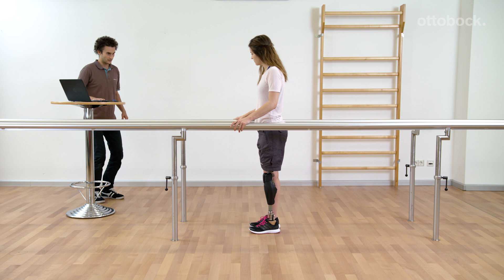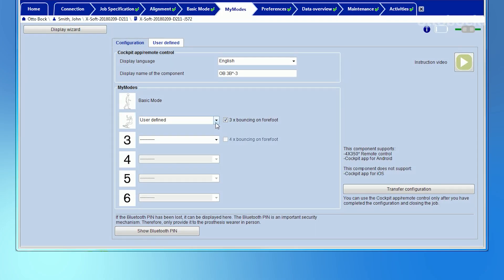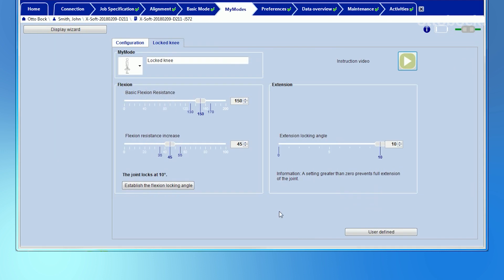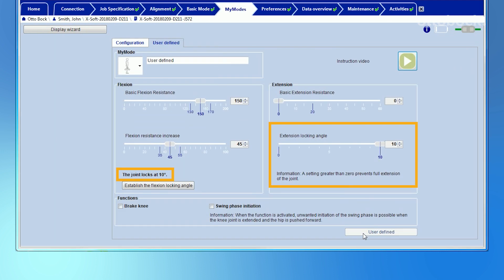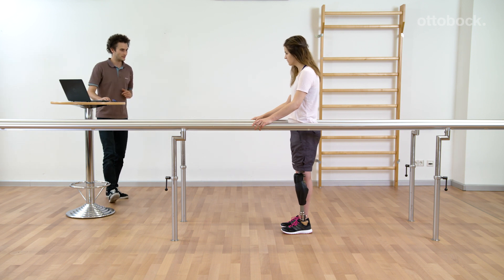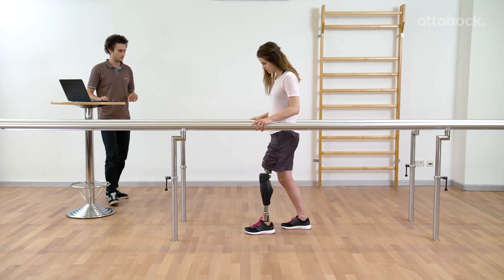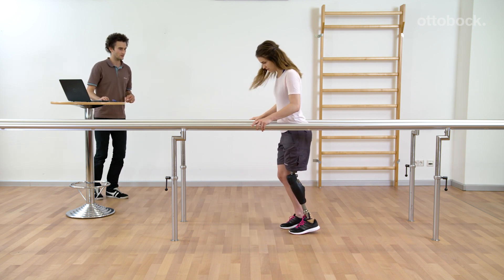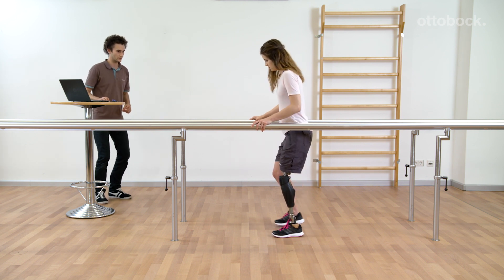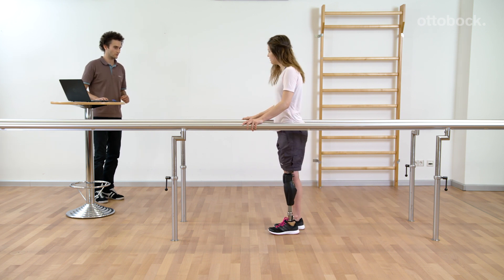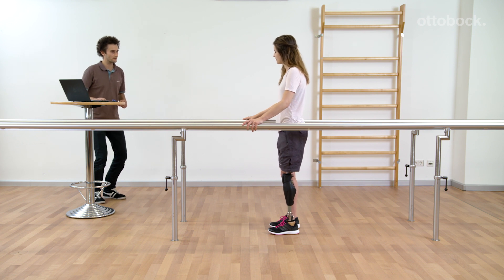Complete extension of the knee joint is always necessary to release stance. However, the extension lock can prevent this necessary knee extension movement from occurring. The last example is the Locked Knee My Mode. This preset restricts the knee joint in both flexion and extension at 10 degrees, meaning it is completely locked in a flexed position at 10 degrees. Adjust the flexion angle first and then set the extension angle to its maximum. To extend the knee joint completely, hold the prosthesis back and in the air for about 2 seconds. It is not recommended to add the stance release function to this setting.